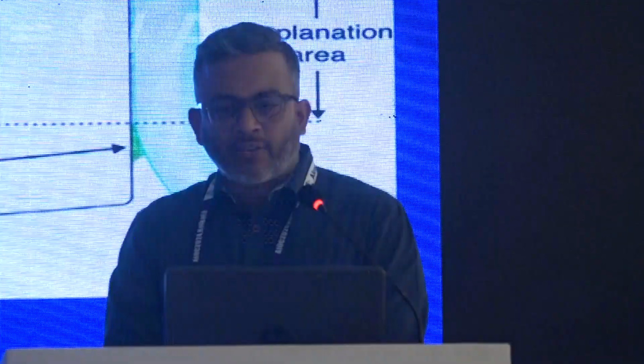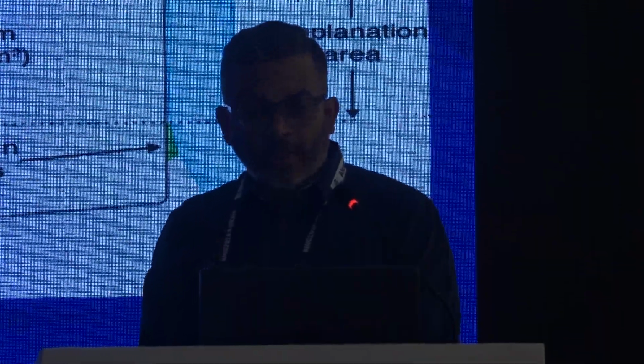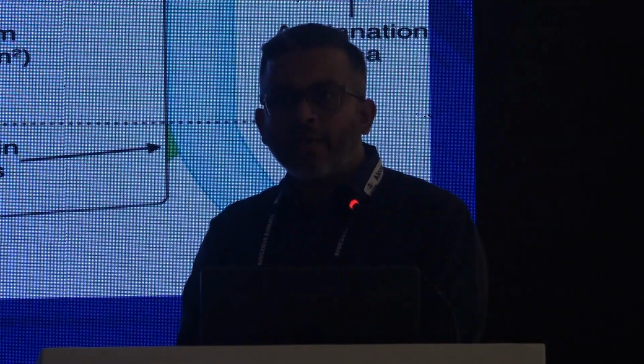Why this area was chosen is because these two major forces cancel each other out. Otherwise, like in Schiøtz, you'd need a nomogram for each different weight. You'd need a nomogram for each different size of tonometer that is required. So, when the diameter is 3.06 millimeters or the area of applanation is 7.35 millimeters square, these forces cancel out. Goldmann tonometer is the most accurate.